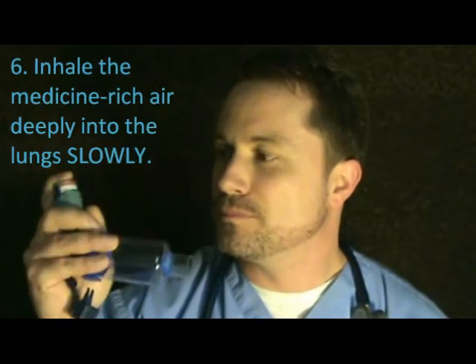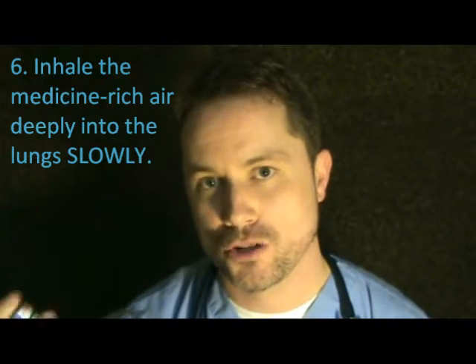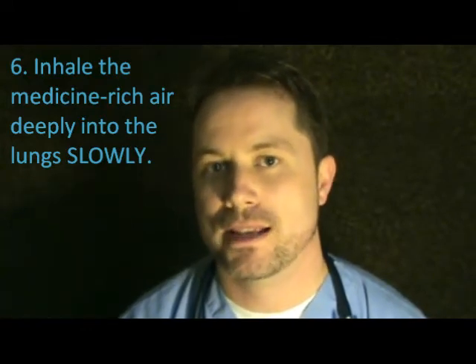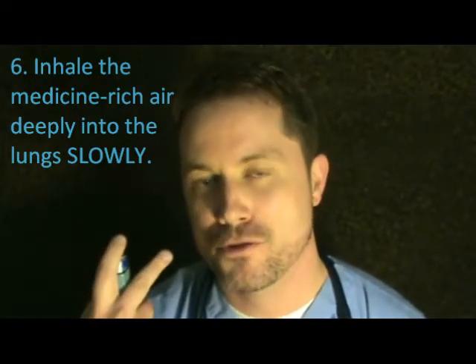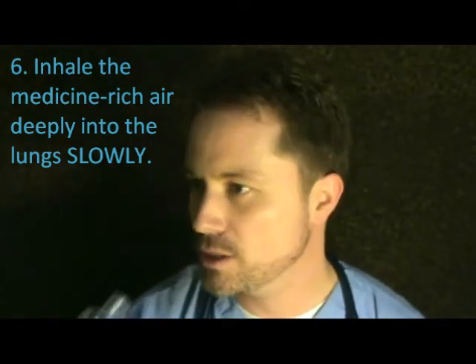Slow, deep breath in, with the breath hold. If you breathe in too fast with the spacer, it'll cause a whistle. That means you're breathing in too fast, and that medication is going to impact the back of your throat, again not allowing a lot of it to make it down. A nice, slow, steady, deep breath in will get more medication down to the lungs.